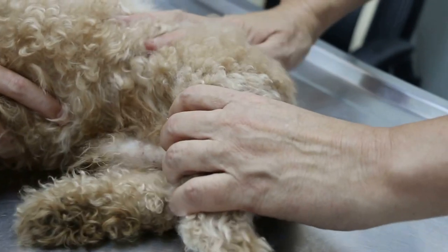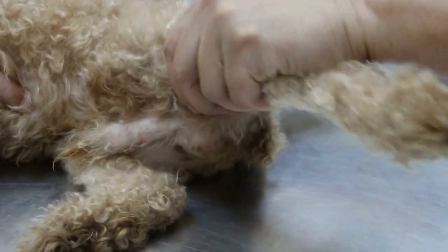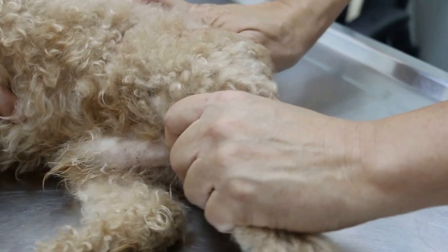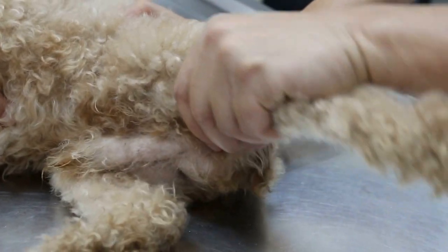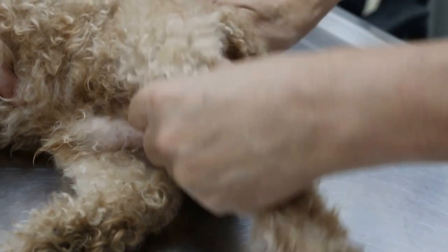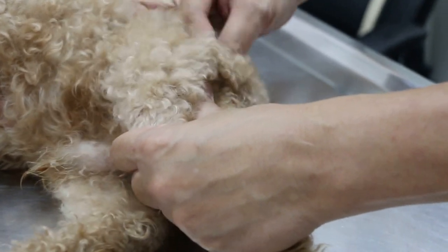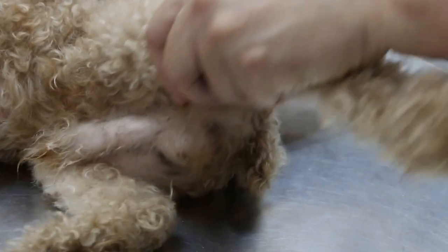So there's no rupture of the anterior cruciate ligament. Now looking at the hip. I can feel the clicking sound. I can try to push it back. On the x-ray you can see the hip joint. I can feel that the ball of the femoral head has come out, and that's why the dog was in pain.